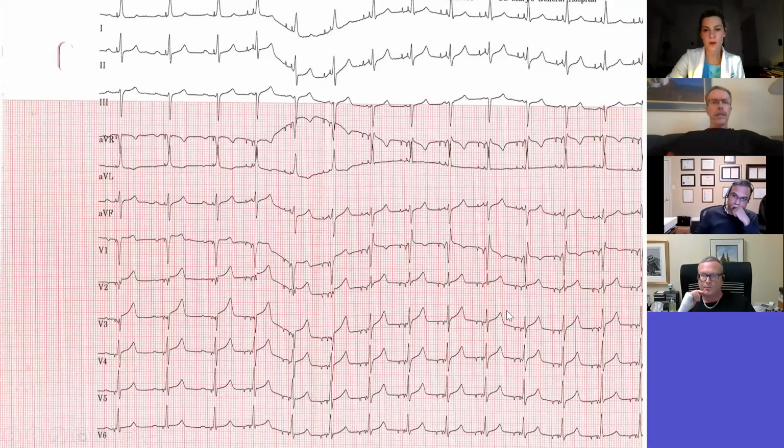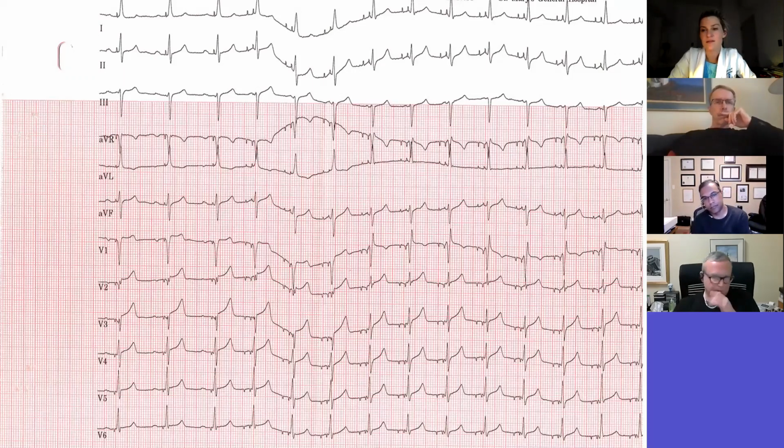Yeah. But partly the point is, if you just do a 12-lead ECG, you often don't see an R prime because you're at a higher output. So in follow-up, you don't necessarily see that classic R prime in V1. You may have, quote, lost it. It also suggests that you really have to take care during follow-up of these patients. An ECG is really important during follow-up, because otherwise your pacemaker nurses will just see the patient and move on, and maybe extend out your AV delays and put MVP pacing on or whatever.